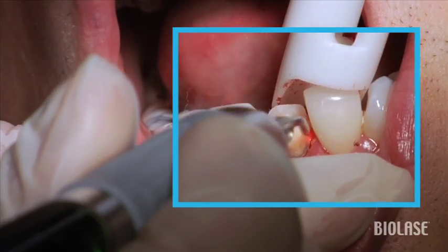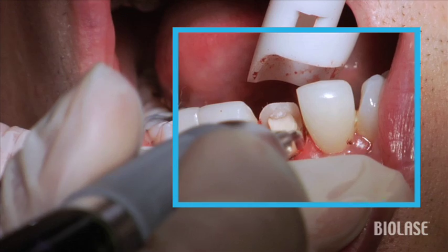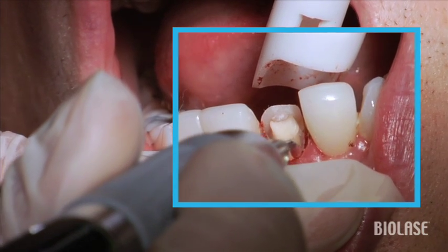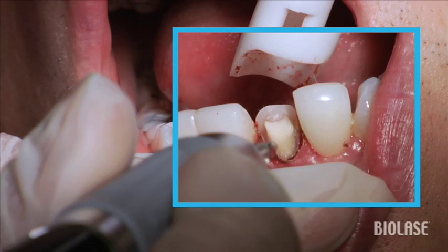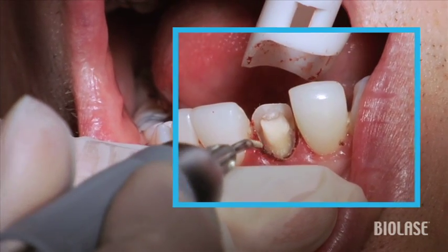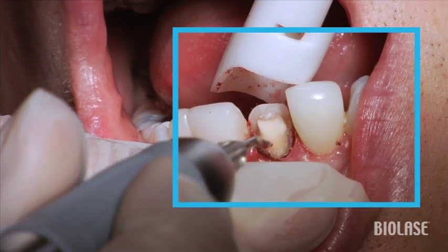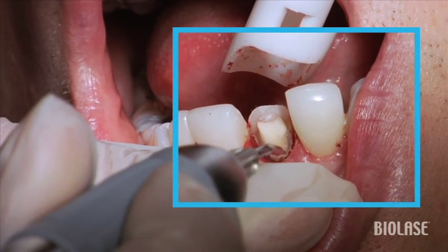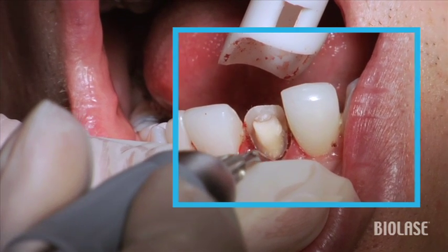Also notice that while we're working, I take the tip out of the tissue quite often. The reason for that is to allow the tip to kind of reheat. Every time you put the tip back into the tissue, it tends to quench and cool down the tip. Notice how many times we're taking the tip out — each time, the tip ends up re-energizing and having the appropriate amount of laser energy to be delivered back into the tissue.